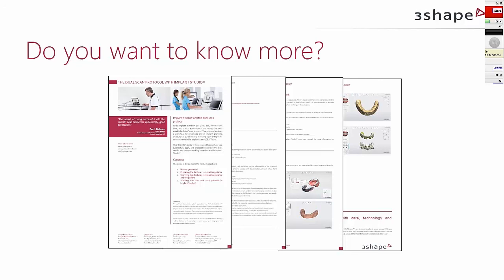So once this is taken care of, the rest will be much easier and much better, to deliver high quality results for the fitting of the guide, but also for the fitting of the prosthetics. We're going to send this document around to you in an email after this webinar. If you're an end user and you want access to this document down the road and you misplaced the one you receive now, then please contact your reseller and they can deliver it to you.